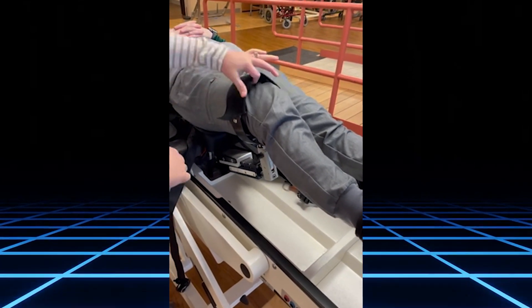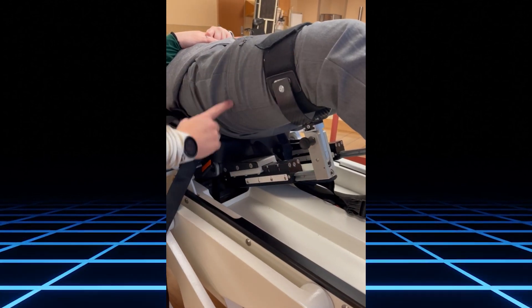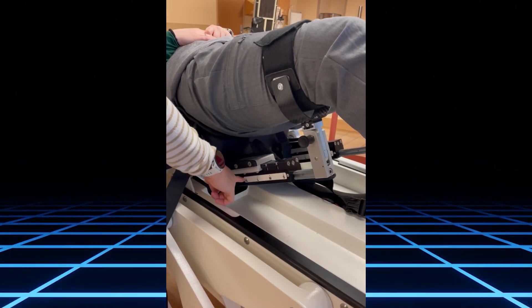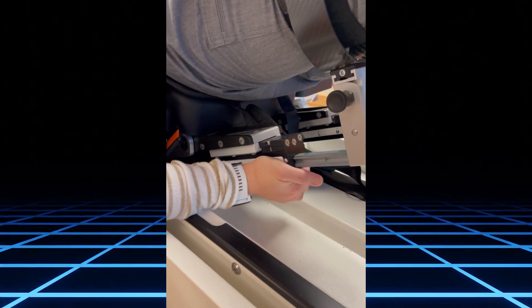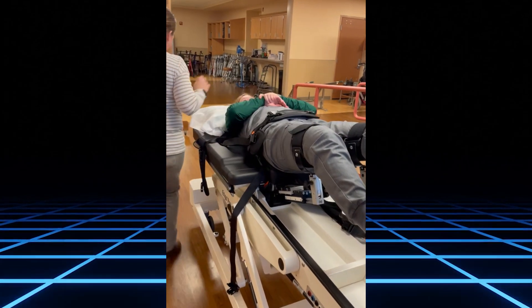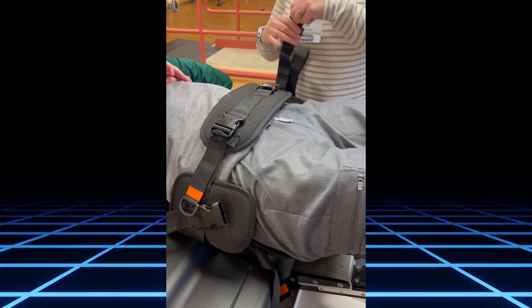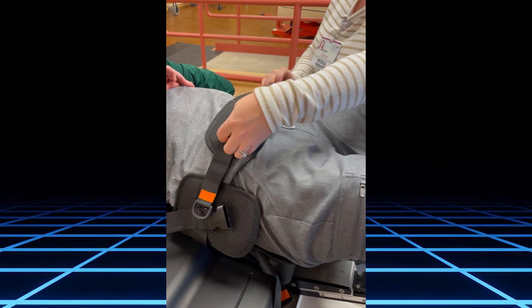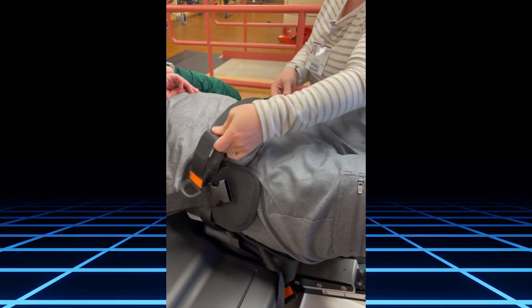There are different leg length measurements: small, medium, large, and extra large, based on the leg length. To adjust them, you just have to manually pull or push. Here's the waist strap — it goes low over the waist and has to be snug. Take these two and just snug it up.